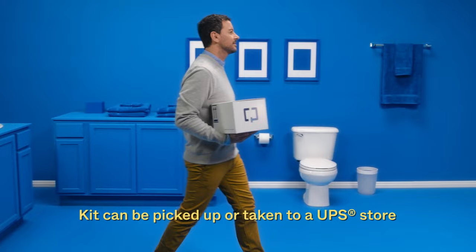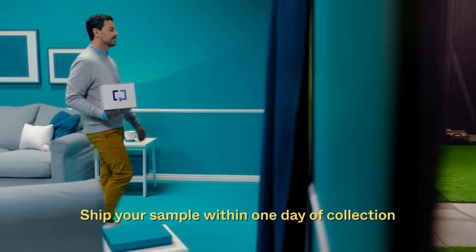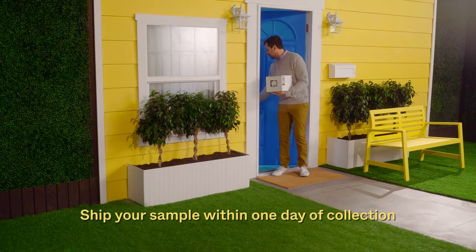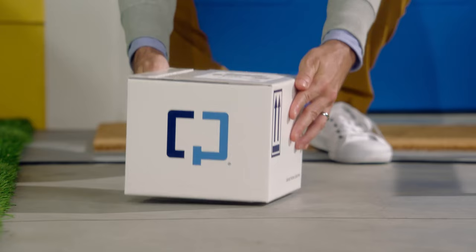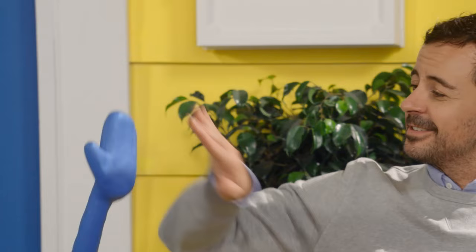You can either drop off your sample at a UPS location or call UPS or Exact Sciences Laboratories' customer care center to schedule a contact-free pickup. Plan to collect your sample when you can get it back to UPS that same day or the next day. The lab must receive your sample as soon as possible, so make sure a Sunday or holiday will not delay your shipment. After drop-off or pickup, it will be shipped directly to the lab. You should hear from your healthcare provider in about two weeks with your result. It's that easy — enjoy the rest of your day.